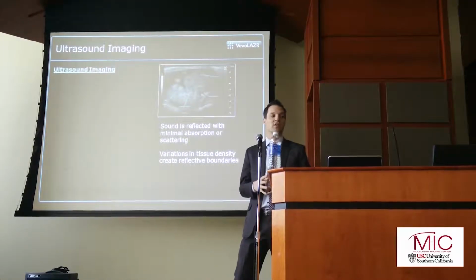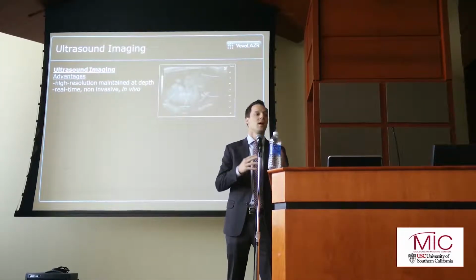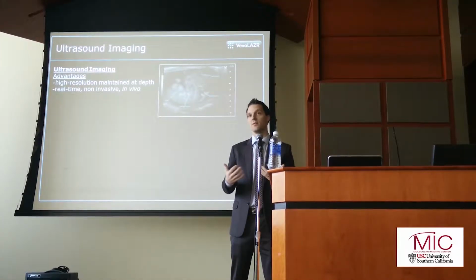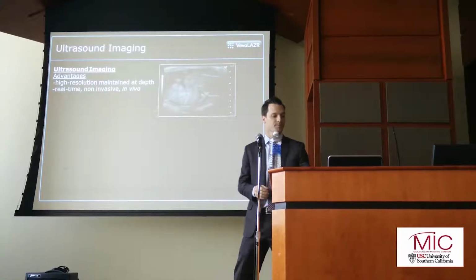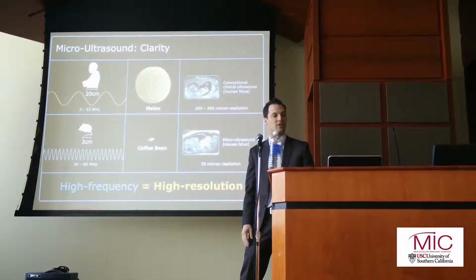And there are several advantages to using ultrasound for doing your imaging. It's an in vivo modality. It's high resolution. The resolution is maintained at depth, and it's real time and non-invasive in vivo. So you can do these longitudinal studies using the same animal as its own control, and so on. And the fact that it's non-invasive is a big advantage as well.